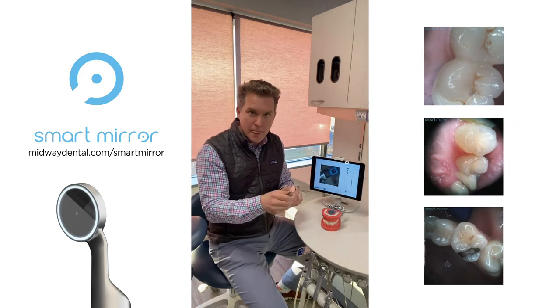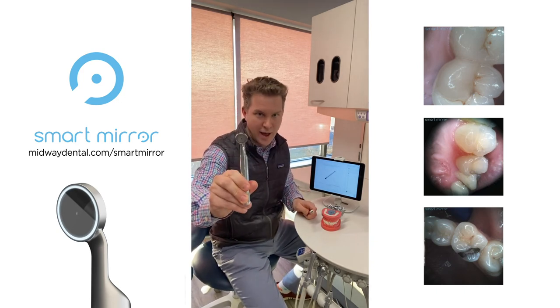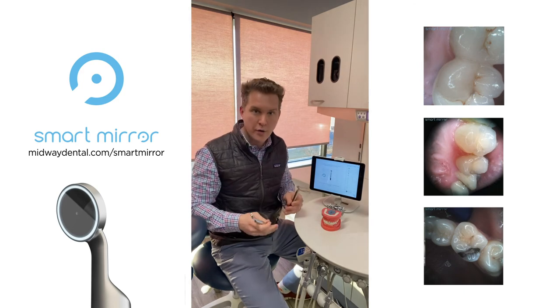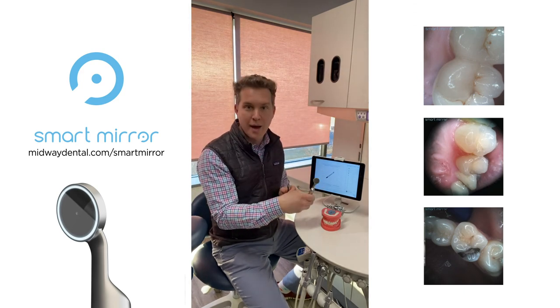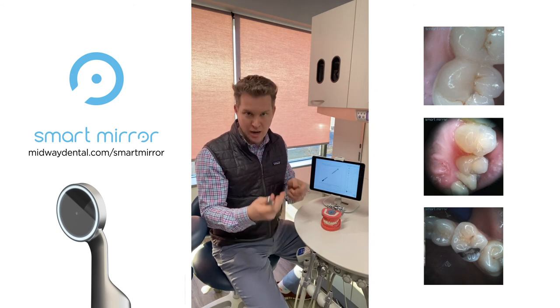When I'm done, I simply separate the two components. The mirror is sterilizable. And because I know you're wondering, you can take the images from the iPad or whatever device you store them on and transfer them over to your imaging software.